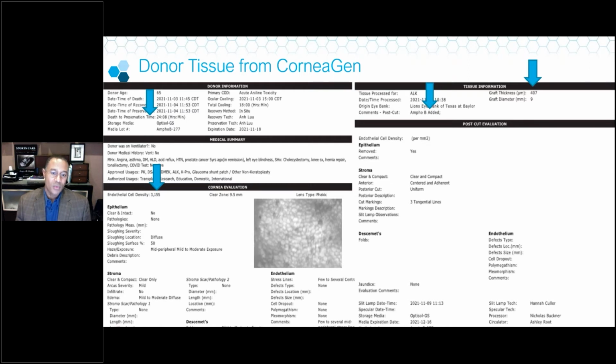And this is what I would do for those people who are trying first off, is go ahead and ask for a cornea that's of PKP quality. If necessary, you can go ahead and actually sew this on as a PKP rather than just doing it as an ALK. But again, for those cases that are near timing out and those cases that have poor endothelial cell counts, they're great tissues for ALK.